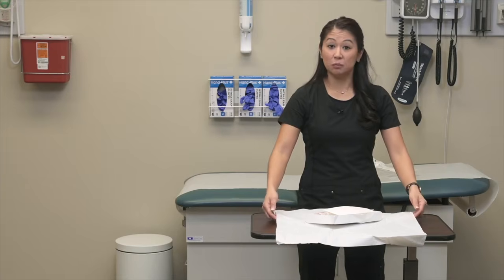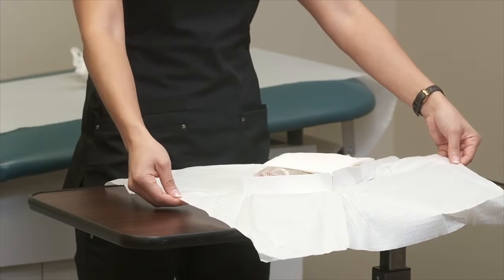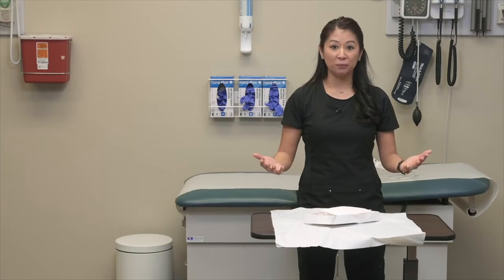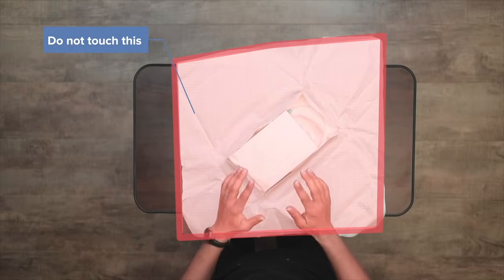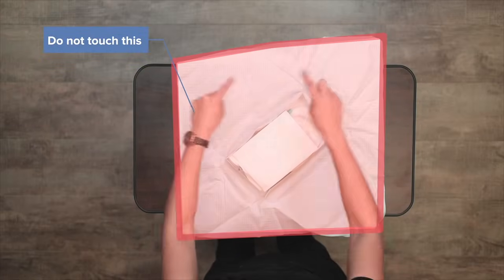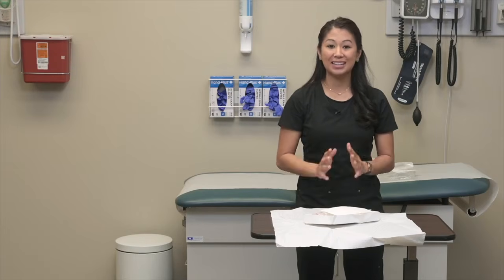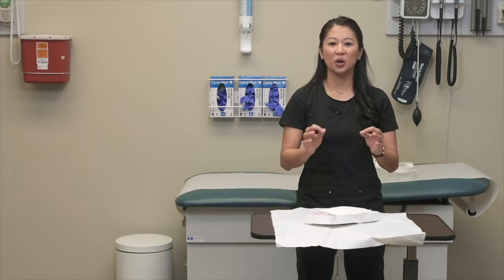So let's say I need to move it up my table. I can touch this 1 inch and maybe move it forward or back or wherever I need it. Now that this is open, I cannot touch anything inside this sterile field and anything inside this 1-inch border because everything inside the package is sterile. And remember, I don't want to leave this and I want to maintain eye contact on it at all times.